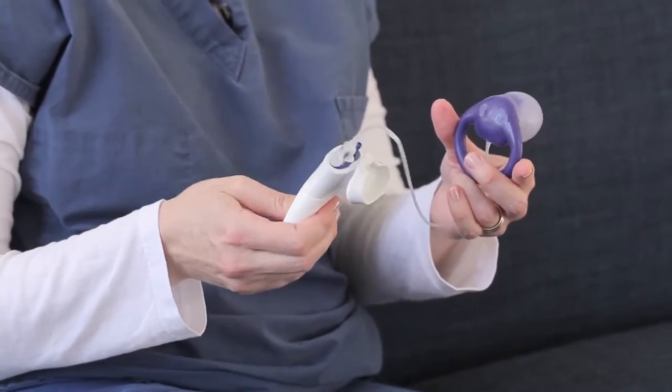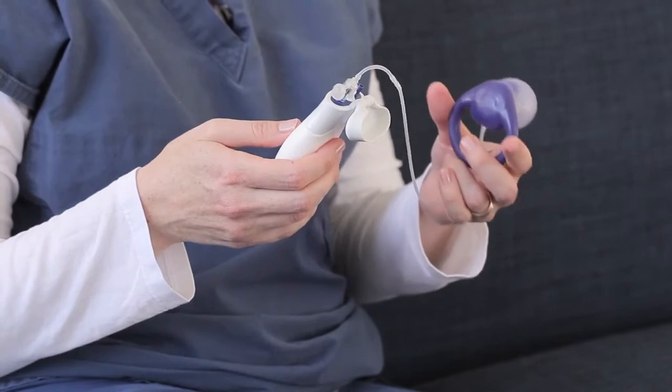If you squeeze it too quickly, you may limit the amount of air that's getting into the balloon. If you wanted to have a bowel movement, you would simply deflate the balloon, and you do not have to take the insert out of your vagina.